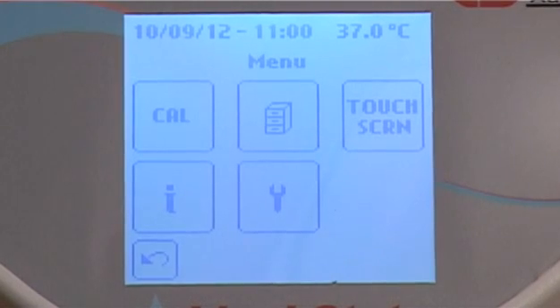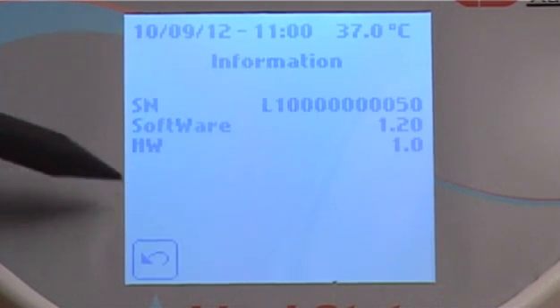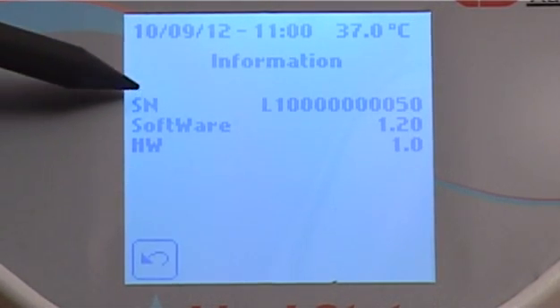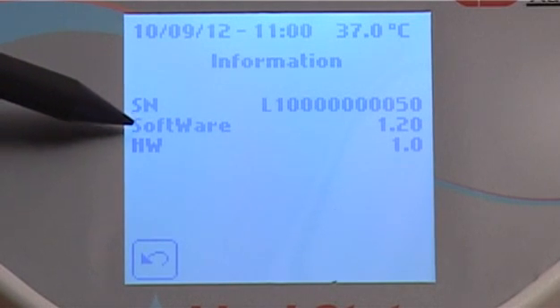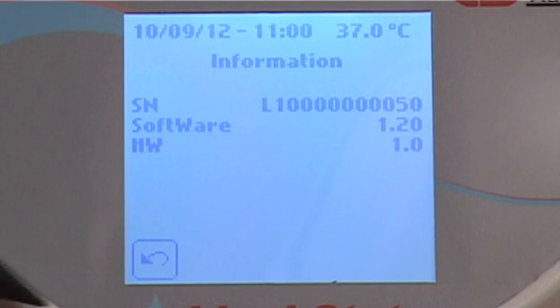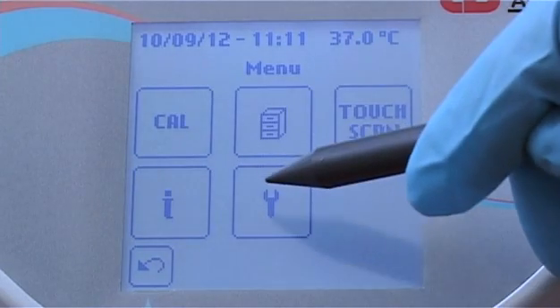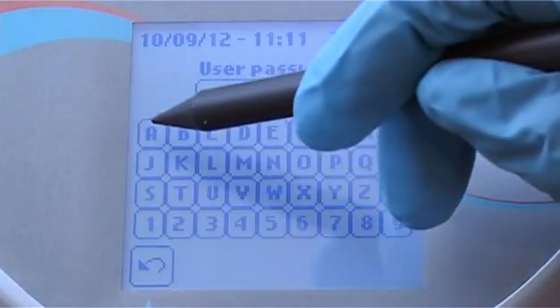The info icon will display the main data about your Liquistat, including the serial number, software version, and hardware version. To access the setup menu, enter the default password: audit.